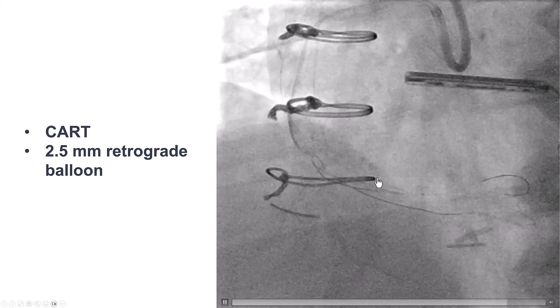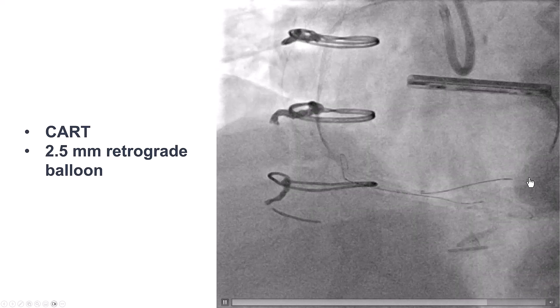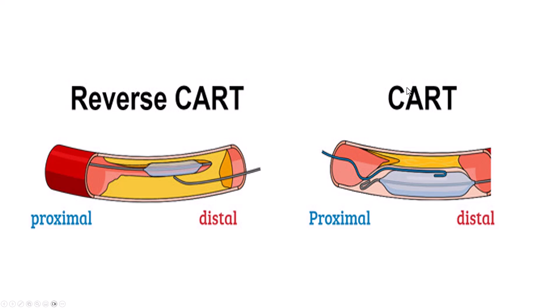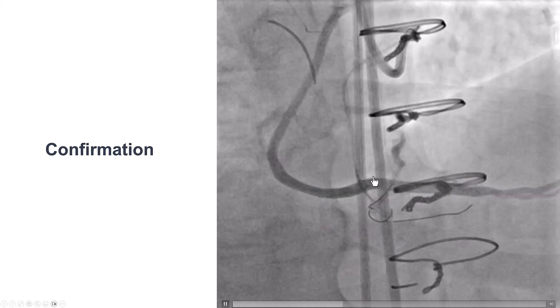So we delivered the retrograde balloon, inflated it, and then as we were deflating it, we advanced the antegrade Mongo wire, which nicely went into the distal true lumen, as confirmed with contralateral injection. And this is how CART differs from reverse CART. In reverse CART, the balloon comes from the antegrade direction, and it is the retrograde wire that enters into the space created by the antegrade balloon. In contrast, in CART, the balloon comes retrogradely, and then it is the antegrade wire that crosses into the space created by the retrograde inflated balloon. Again, in our case, this was feasible because we went retrograde through a saphenous vein graft — this may not have been possible through a septal, and especially not through an epicardial collateral. We confirmed that the antegrade wire was indeed in the distal true lumen.